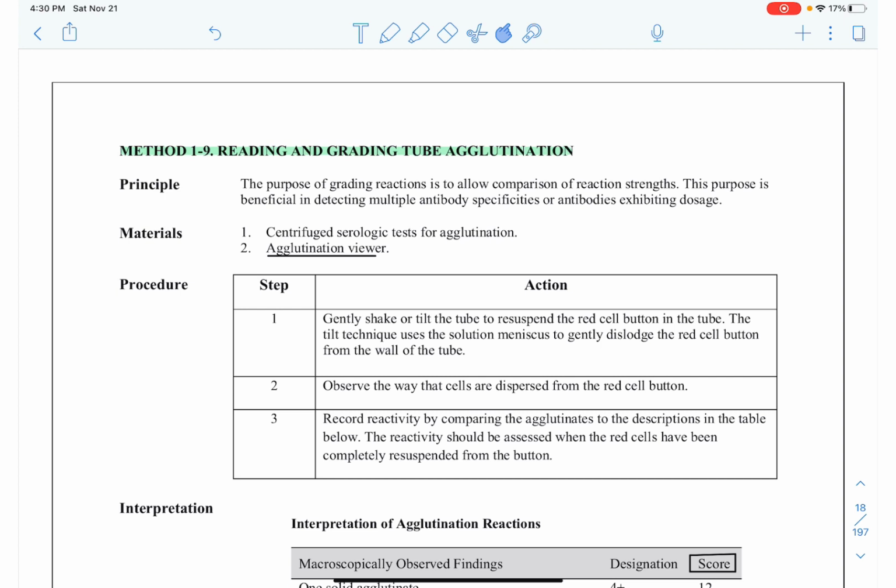An extremely rare antibody known as anti-ENA is very clinically significant. And this example demonstrates that an investigation is warranted when weak reactions are observed during phenotyping. In this case, the serologist noted the N was weak plus, and variant or null antigens can demonstrate weak phenotyping.